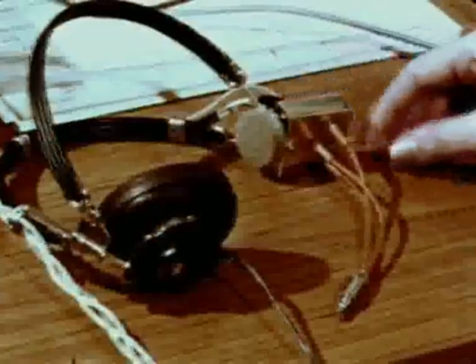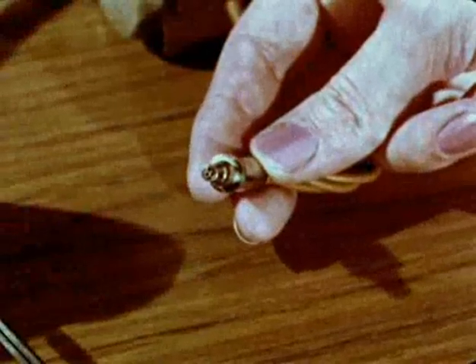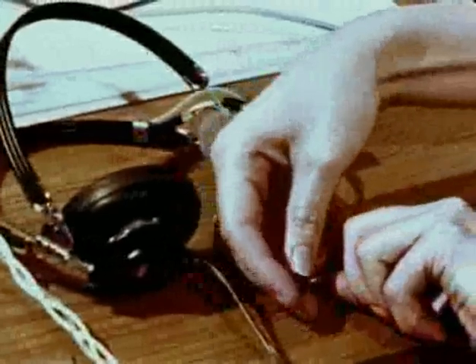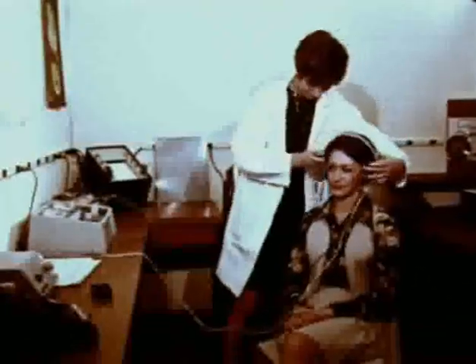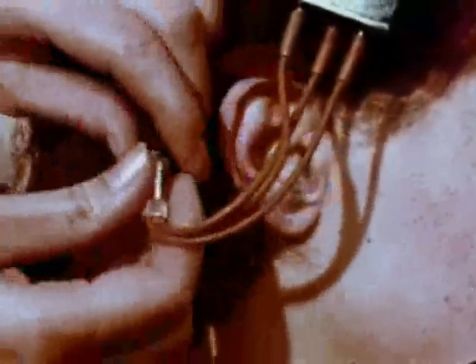One of the essential practical features of the equipment is the probe, which fits into the external canal with an airtight seal. It has 3 holes, to which are fitted rubber tubes connected to the sound source, the probe microphone, and the air pump. A variety of rubber tips are available for the ear probe to ensure a comfortable, airtight seal. After selecting a tip of appropriate size and ensuring that the ear canal is free of debris or wax, the pinna is pulled upwards and backwards and the probe gently fitted into the ear. It may be necessary to try an alternative size of rubber tip.